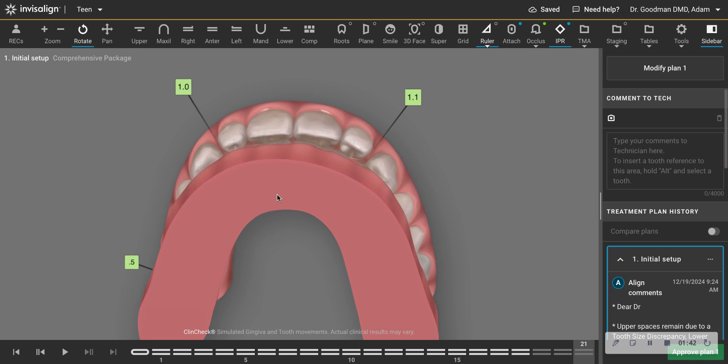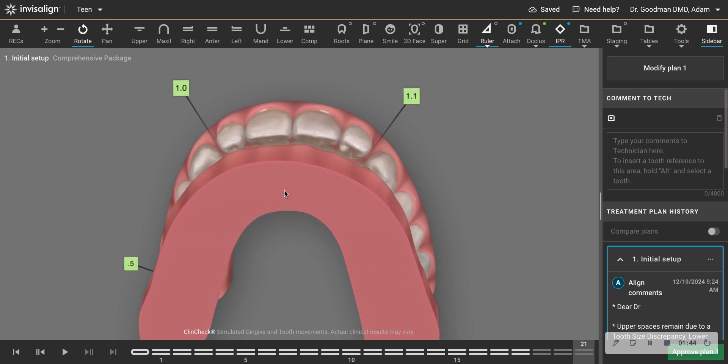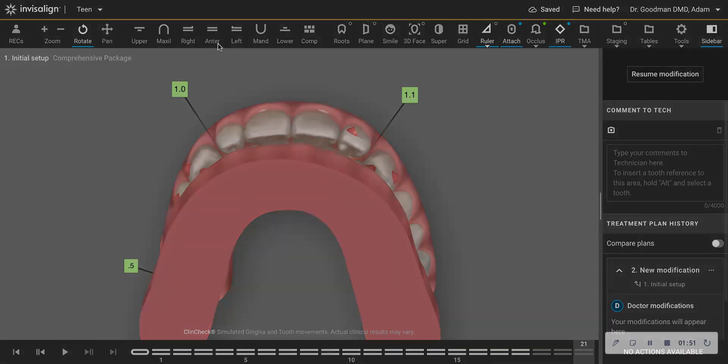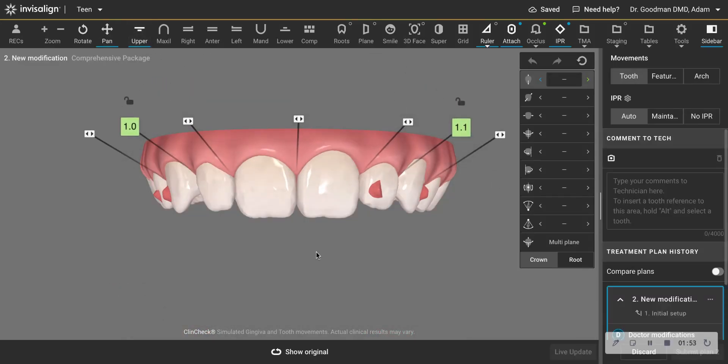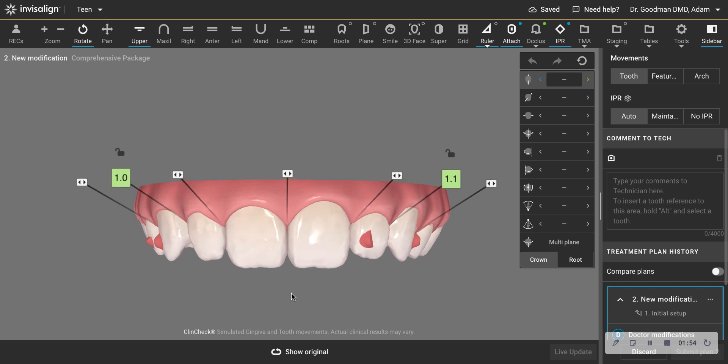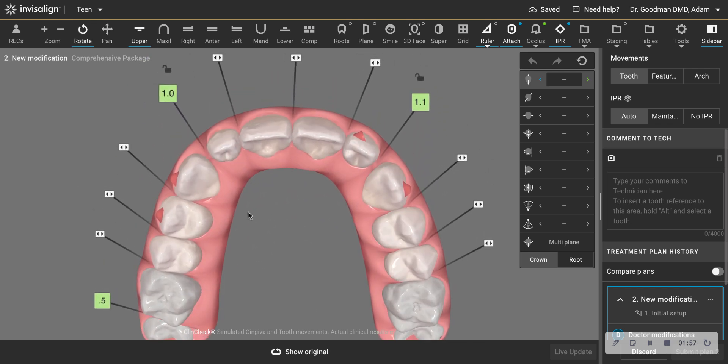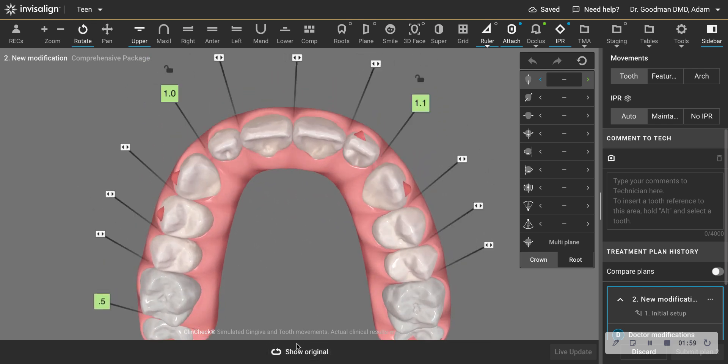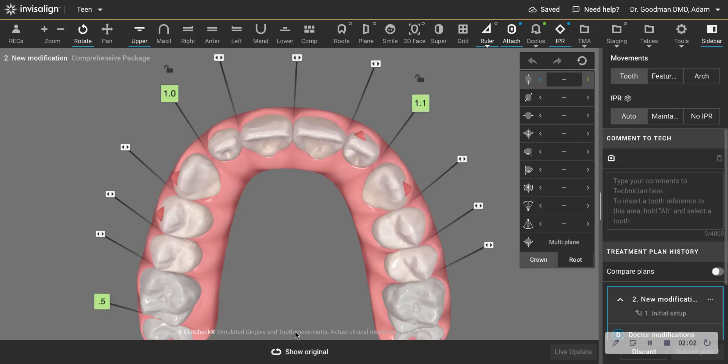here's my overjet and very slight overjet. I'd like more overjet, but I don't want to open up more space around those lateral incisors. So the modification I'm going to make on this, that I think will give me more overjet, also happens to be moving these teeth the way they really want to move. And that is with less root torque.